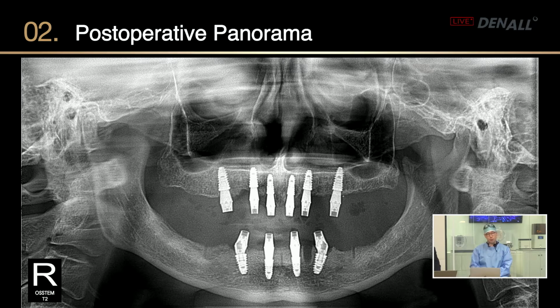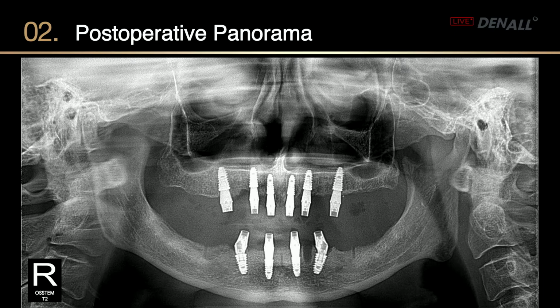The temporary hex positioning and all the processes were made possible thanks to the members of the R&D Center, especially Dr. Jonghyun Park, Dr. Cho or Dr. Kyungwon Kim. And thanks to them, I was able to do the surgery. I just implemented the surgery based on their protocol.